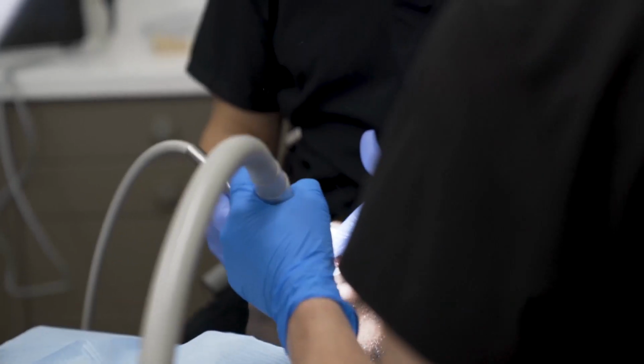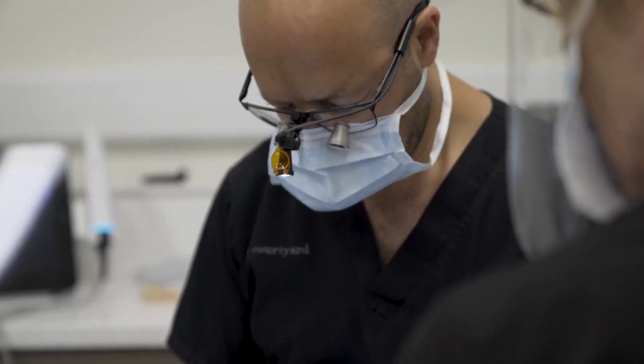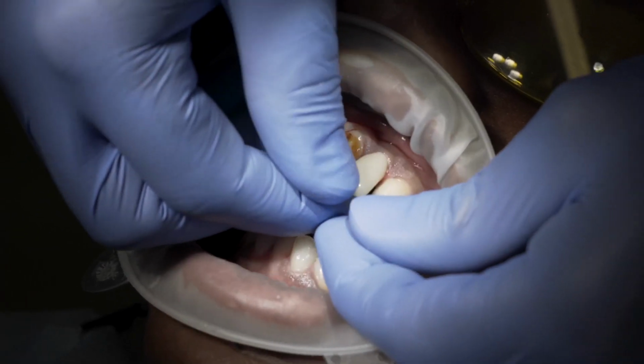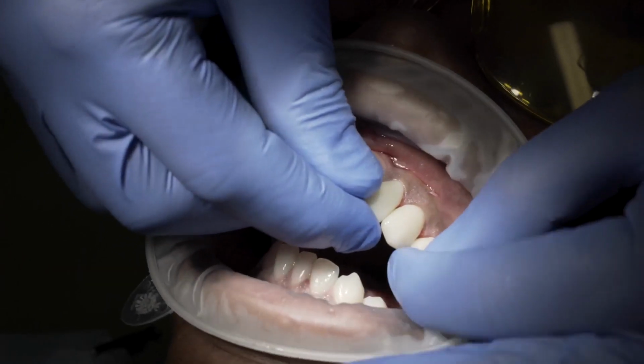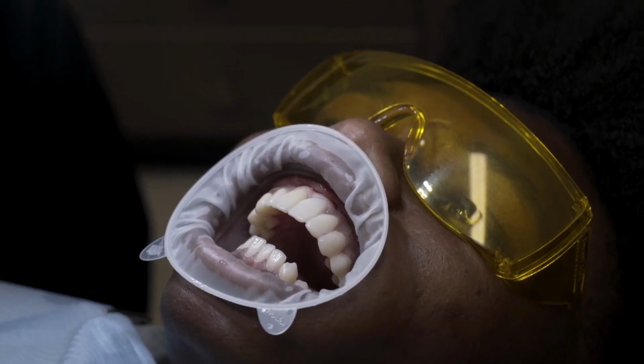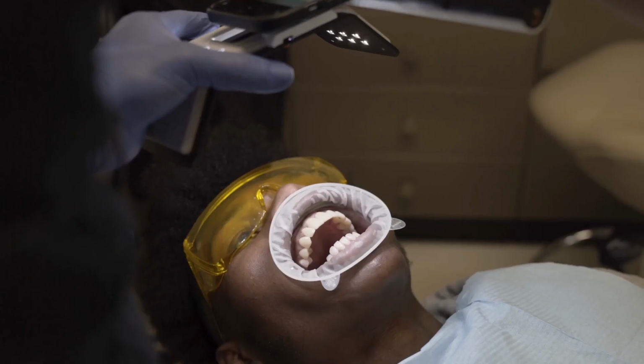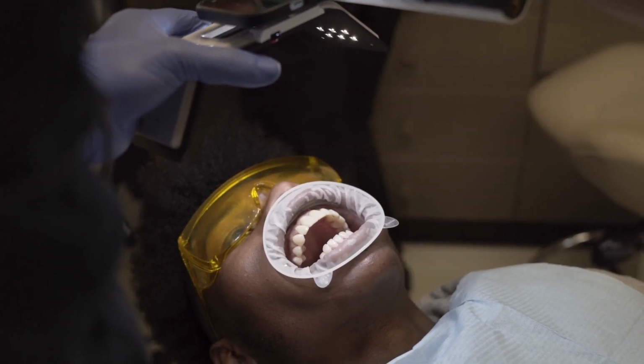So then the other question is, what are the aesthetics like? If we'd never seen any dental material before, we would have to agree that something that most resembled enamel, that was translucent and could show the underlying texture of the tooth coming through, is probably what we consider ideal now. For me, up to press, zirconia has looked its best when it's in really thin section and when it lets the natural aspects of the dentine glow through. As such, SprintRay resin for me best replicates that.